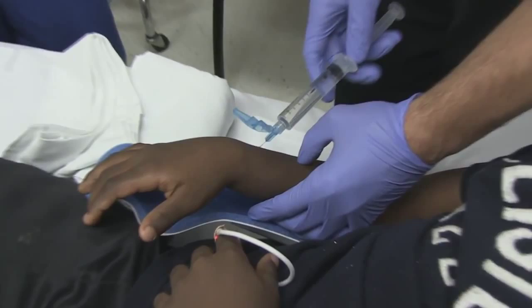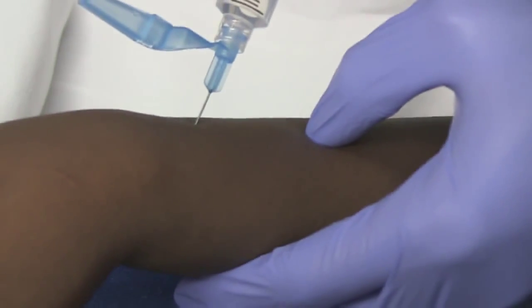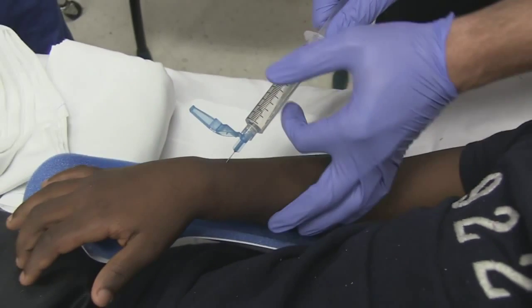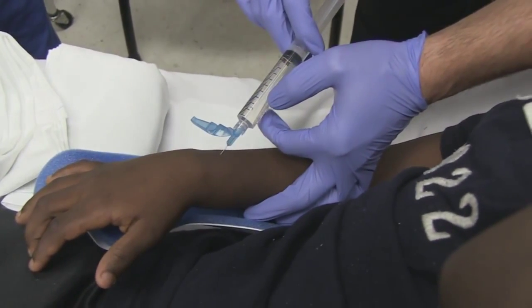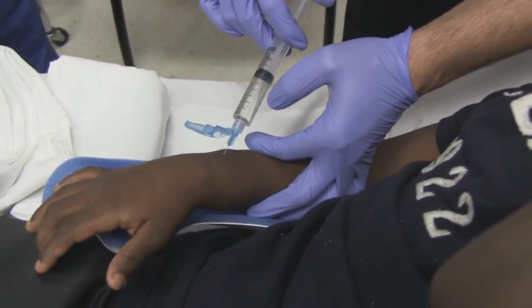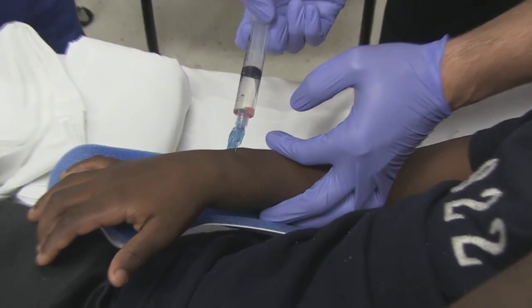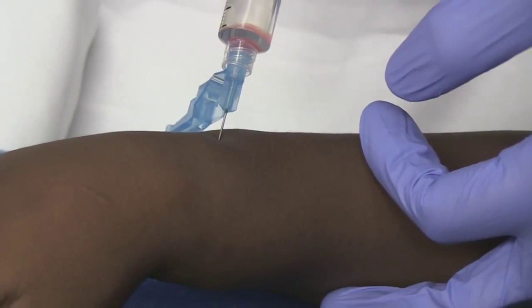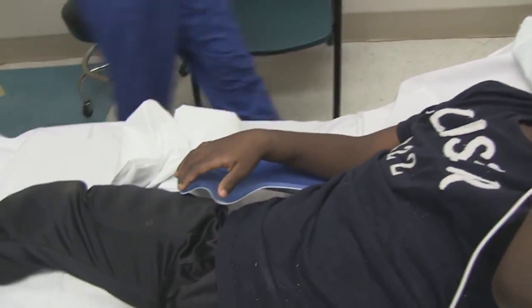Just angle it. I don't feel that way. Sometimes it's better than that. You can always feel like you're hitting bone. I know, buddy, I'm sorry. Feel great, buddy. You may or may not get one, but — I think that's it. Should go in pretty easily. And if you just bathe it around there, it works just fine. It'd be ideal to aspirate back and get some blood, but that doesn't happen every time. Most times you'll get some there — there's a little blood. Again, it should flow easily. If you blow up the surrounding soft tissue, you know you're still outside of it. Wasn't too bad, was it, man? You did great.